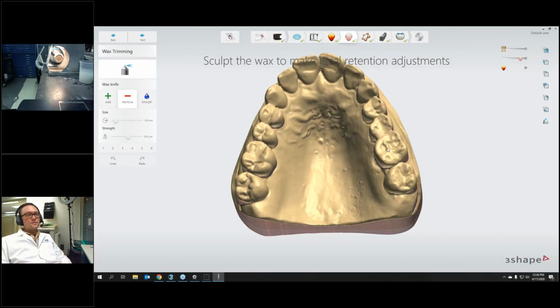That is one issue, especially in full arch models. There can tend to be issues if the intraoral scan strategy hasn't been followed, then you can get overlapping of surfaces or a kind of cross arch expansion or contraction as these scanners cross the midline. If you're not following the manufacturer's scan strategy for crossing the anterior, that's usually where you have those issues. And then you could see that you're having a problem with fit in that regard.